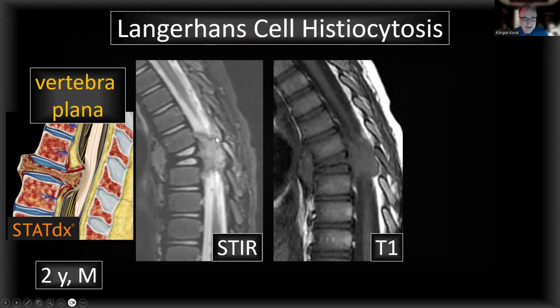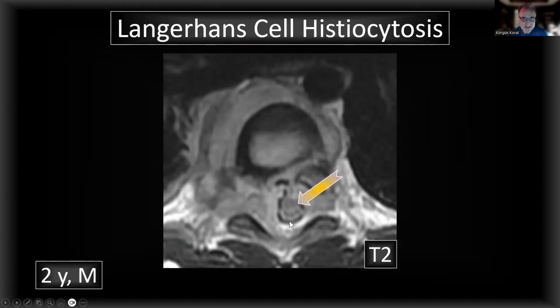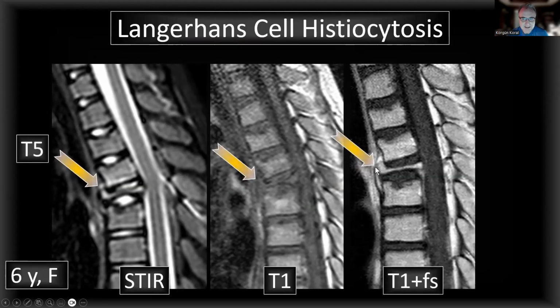There is a large intraspinal and prespinal component, which shows quite intense enhancement following administration of intravenous contrast material. And on the axial images, there will be corresponding narrowing of the thecal sac. Another example resulting in focal kyphosis. Again, the intervertebral discs are intact, vertebra plana, and there's a smaller prespinal component, but no epidural component posteriorly.